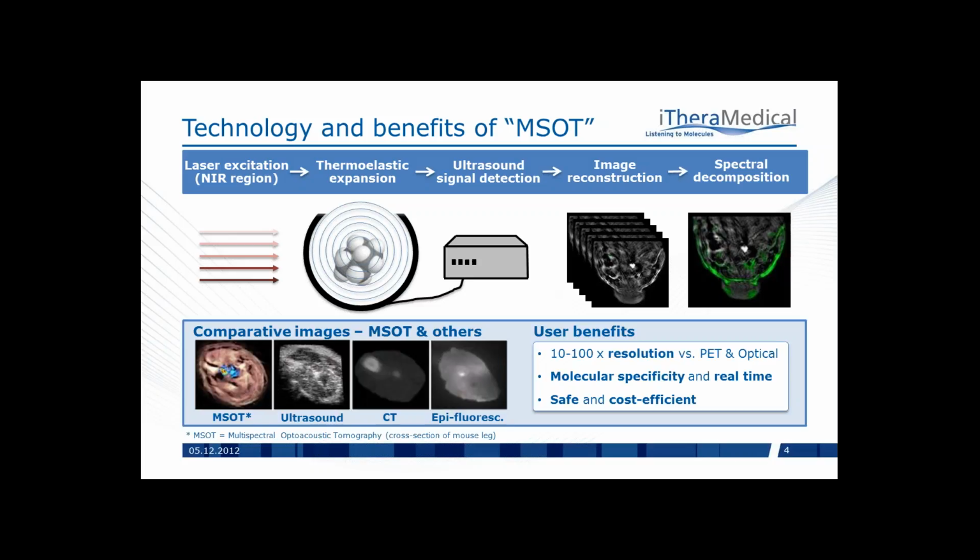So the advantage of MSOT then over other modalities as compared to ultrasound, CT, or epifluorescence, if you look at a cross-section of a mouse leg that was injected with a molecular probe, is that with MSOT you can see structural information such as the bones and vessels.